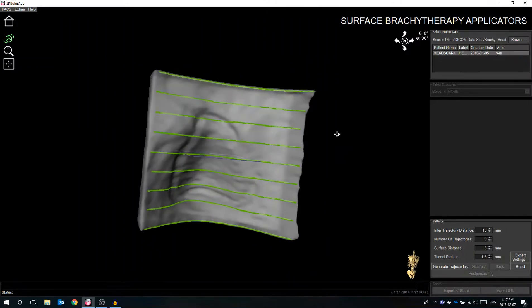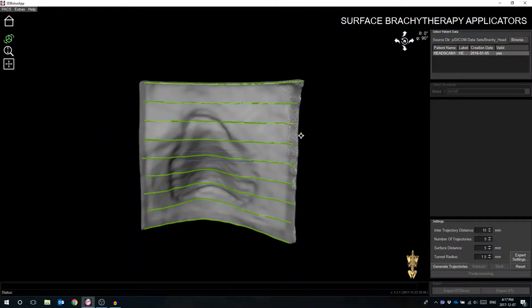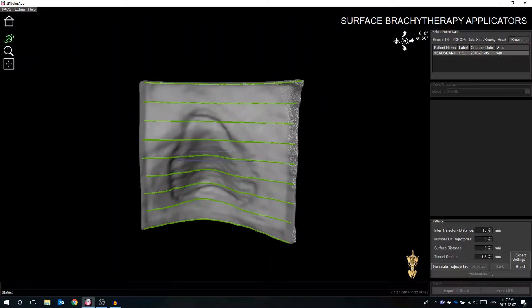This prompts the software to open a 3D render of the structure designed from the patient's CT scan in order to perform the necessary modifications.